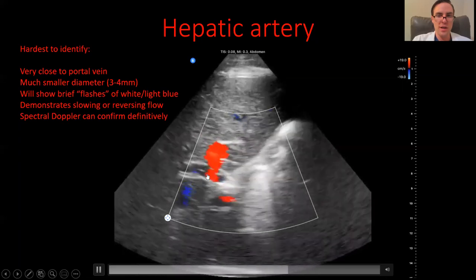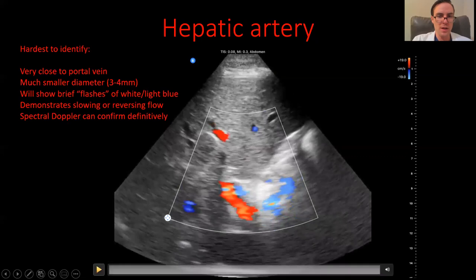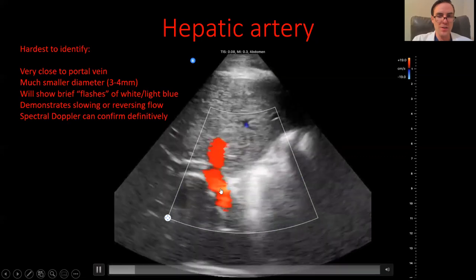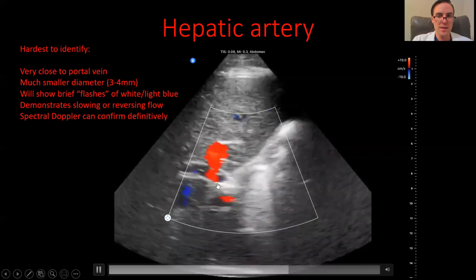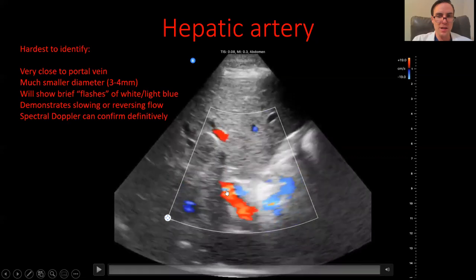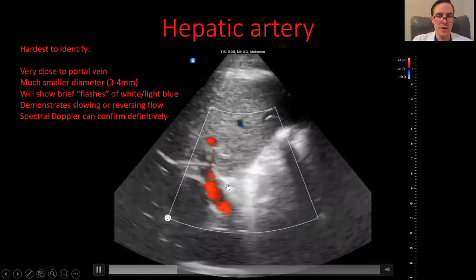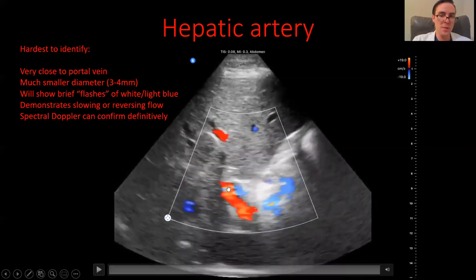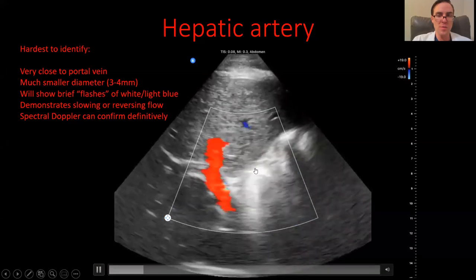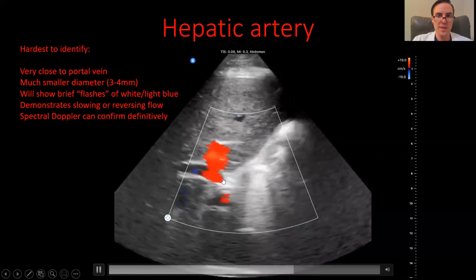The dark red consistent stuff is of course the portal vein, but the hepatic artery is this little flash right here — you can see it flashing light blue intermittently, right here. That's part of the hepatic artery. Just remember it's much smaller, so it can kind of get lost in the mix with all the flow going on with the portal vein, but that's it right there.